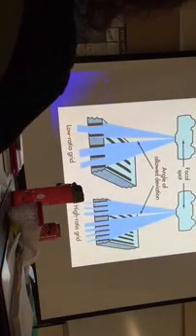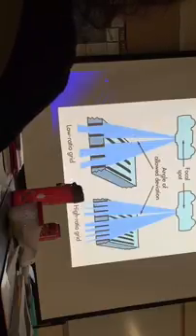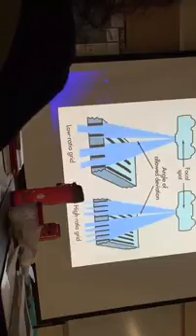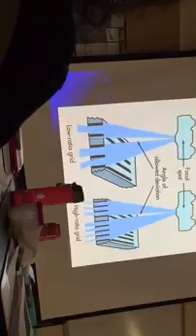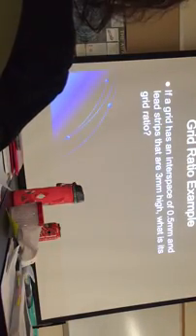So this is what you have. With low ratio grids, it's easier for both primary and the scatter radiation to go right through it. With high ratio grids, yes, you have more absorption of the scatter radiation, but also more absorption of the primary beam. Okay? Yes? Okay, good.